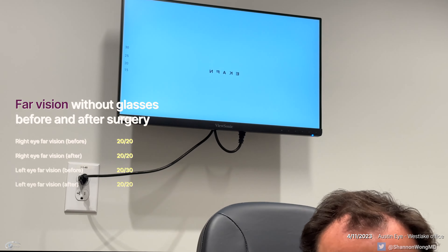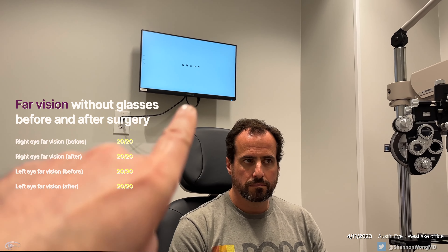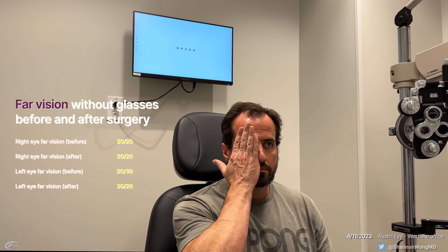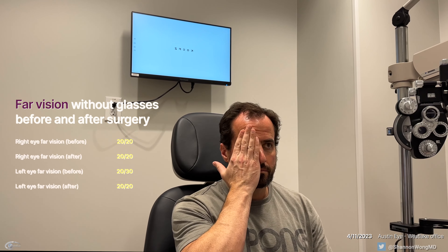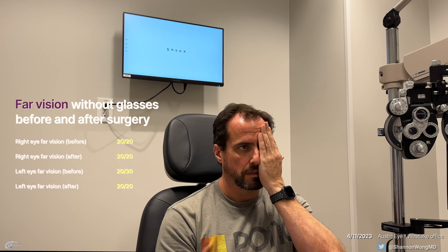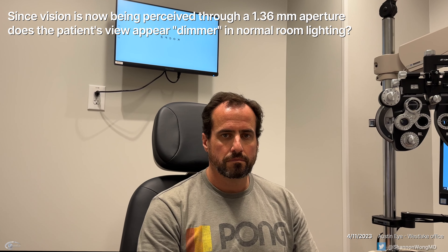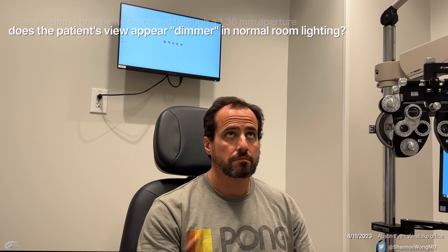So if we're looking up at an eye chart and you compare the quality of vision on those letters, can you cover and uncover — which eye seems to see better? I would say the right is still better. That's fine, because it was in better focus to begin with. And then looking in the room, do images look brighter from your right eye than your left eye? About the same. No dimming.